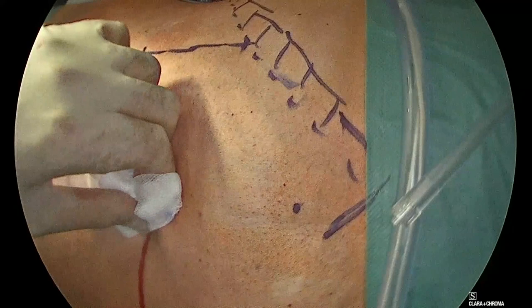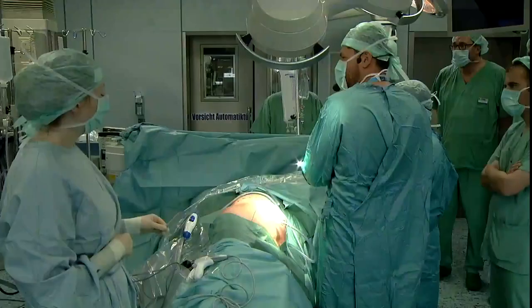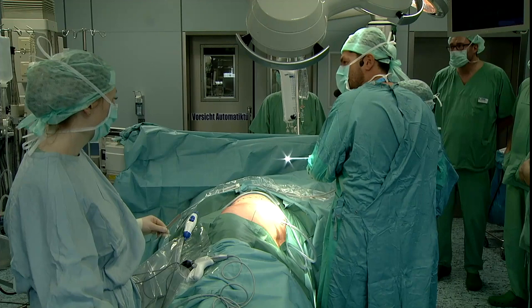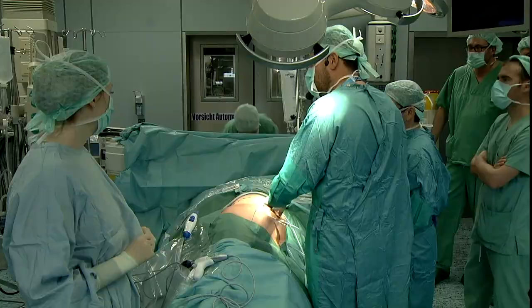Once this is done, we can make a small incision and access the abdominal cavity via a visual trocar. So now you see I'm inside a trocar, and I focus on the tip of the trocar. What is nice is that today we're using the 4K from Storz, and this is really a superlative vision. I hope I will be able to show you a nice case. So you see we make a real small incision. This is a 5 millimeter incision. Look at my finger, really small incision.